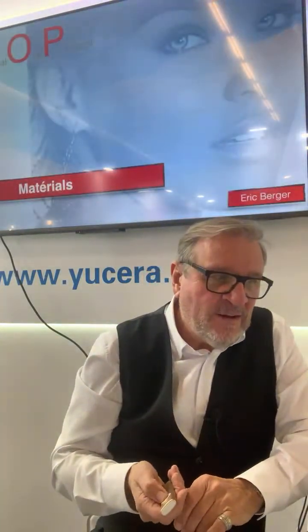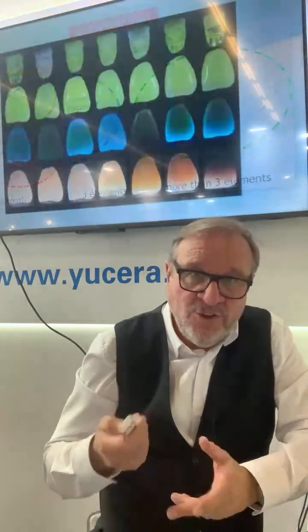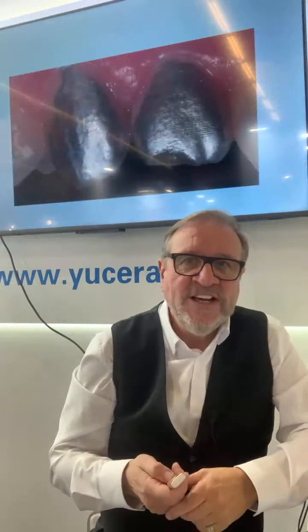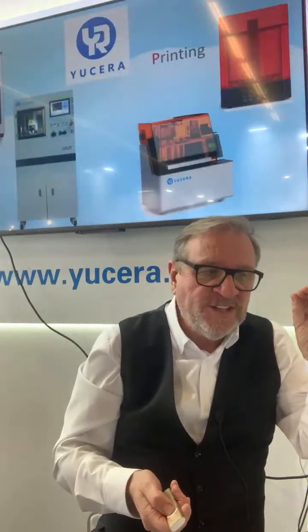So the POP protocol uses every kind of material and uses zirconium oxide, having the right shade. I made this focus during all that day, and also the shade is important, the micro surface is also important. We are going now to the topic of aesthetics.